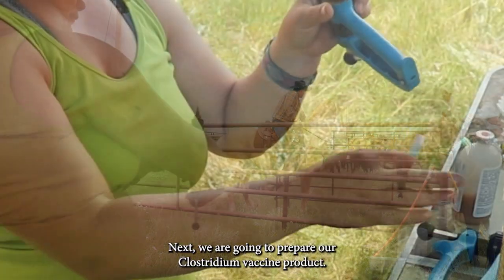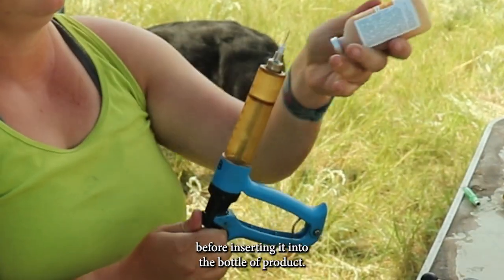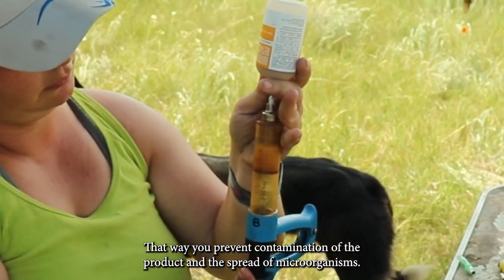Next we are going to prepare our clostridial vaccine product. It's always important to put a new fresh needle onto the syringe before inserting it into the bottle of product. That way you prevent contamination of the product and the spread of microorganisms.